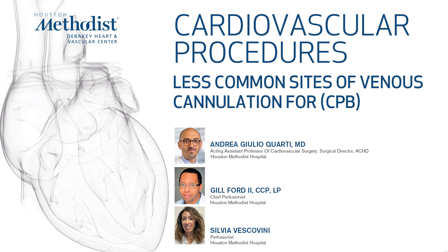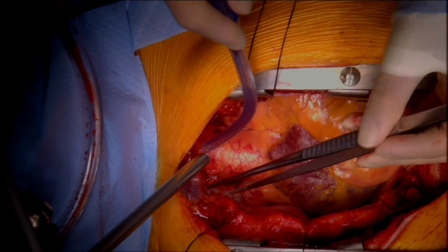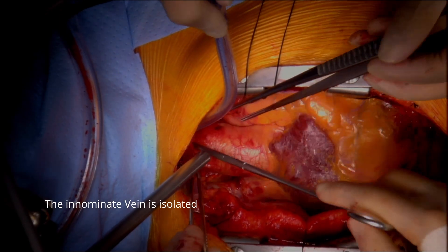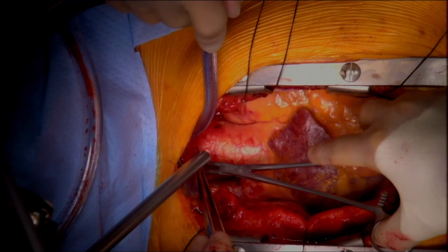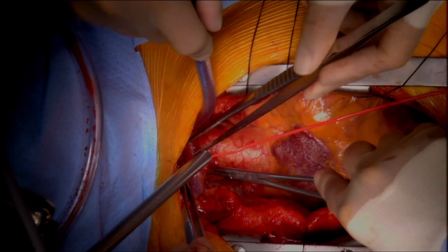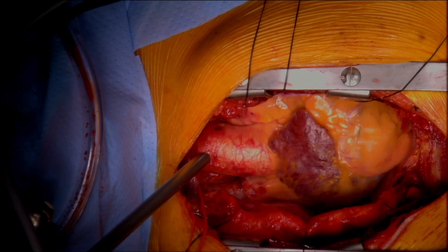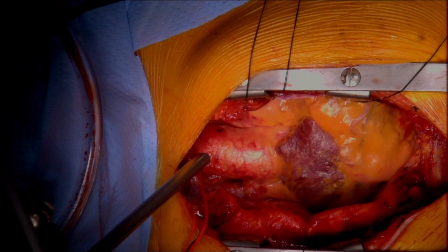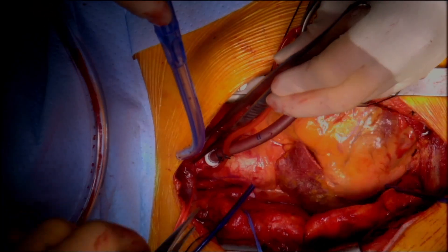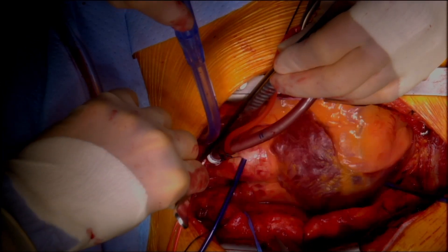One of these sites is the innominate vein. It is isolated and an umbilical tape is passed around it to control blood flow. A purse-string suture is placed and an incision is made to insert the cannula.